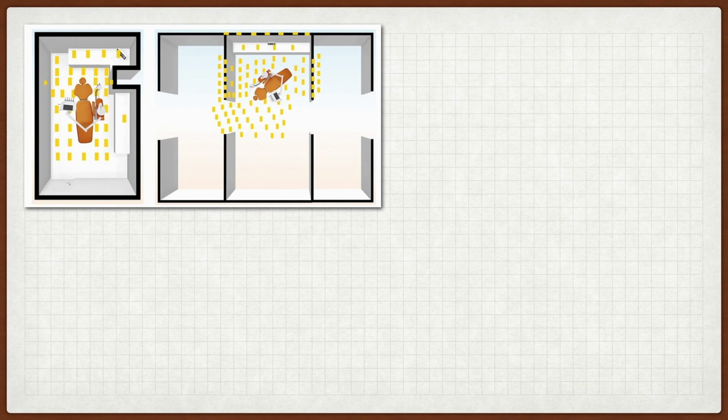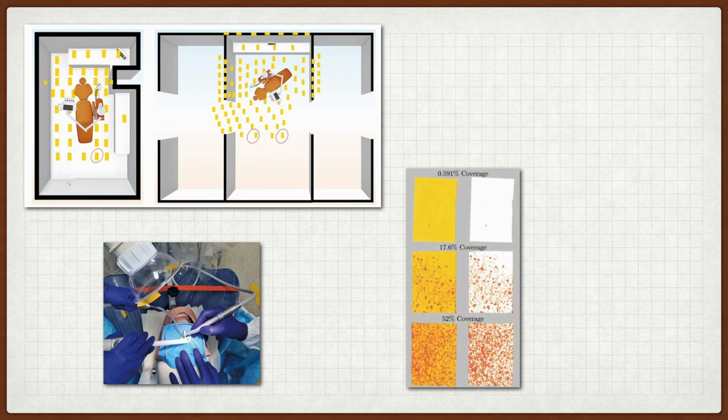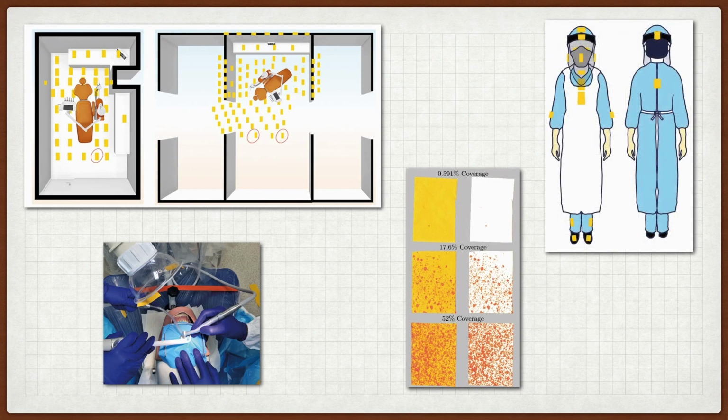The experiments were conducted predominantly in a closed surgery, with some procedures replicated in an open multi-chair clinic. To avoid unnecessary risks, a dental mannequin with thermoplastic teeth was set up in a dental chair to simulate the patient. To visually indicate contamination, UIPs with a sensitivity range of pH 1 to 14, which chromatically change to red on contact with citric acid solution, were placed in strategic locations in the operatory, on the clinician and assistant. Dental procedures were performed with and without EOS devices.